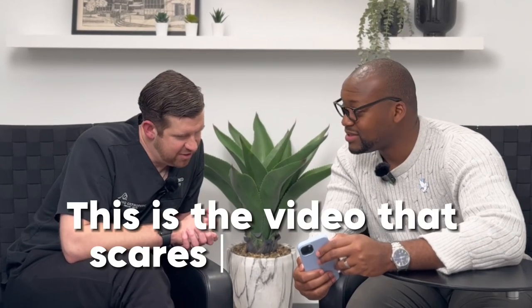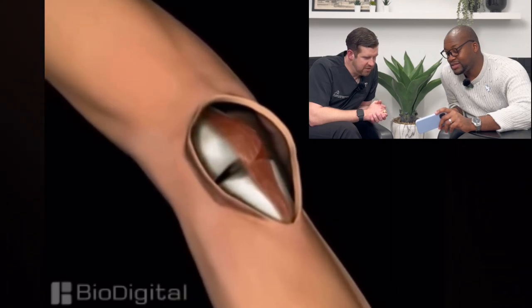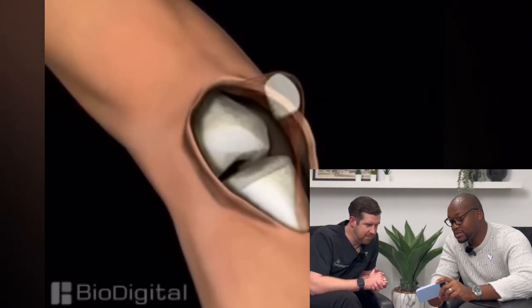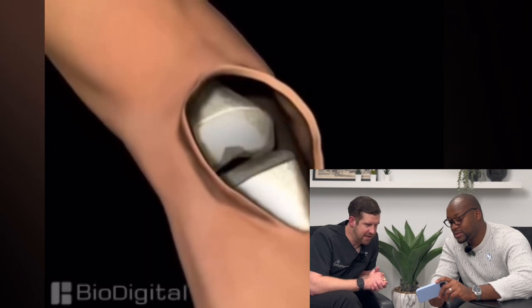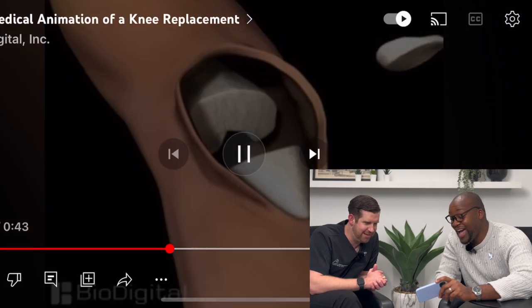This is the video that scares everybody because in that picture they just took a huge chunk out of the knee. Starting off normally you open up the incision and you need to actually be able to see to put the pieces in, so they flip the patella up on the side — usually you replace that — and here they take a huge chunk of bone out of both the femur and the tibia.